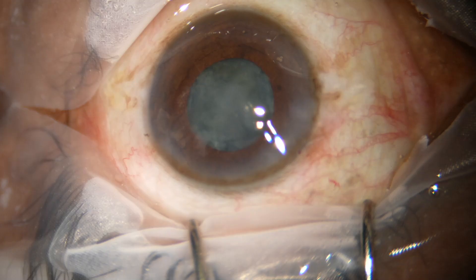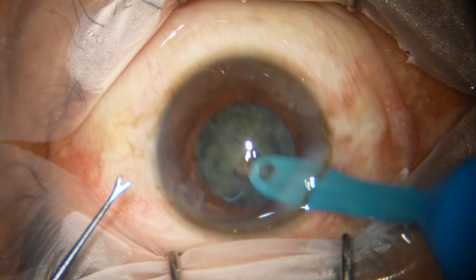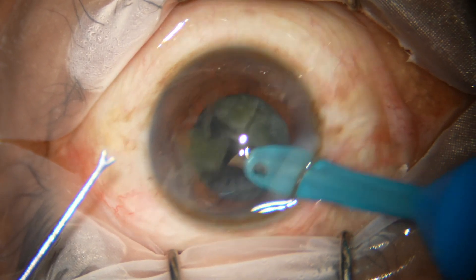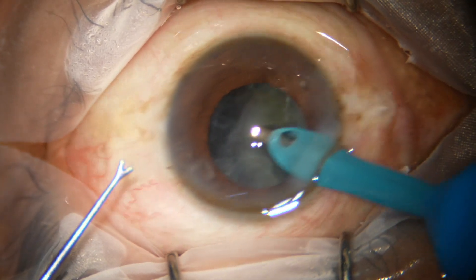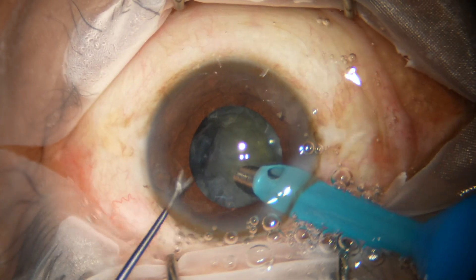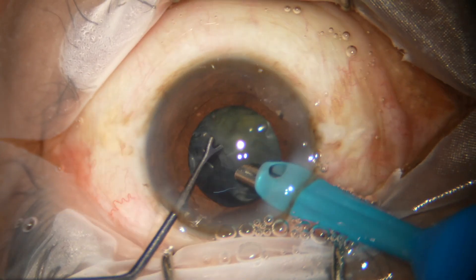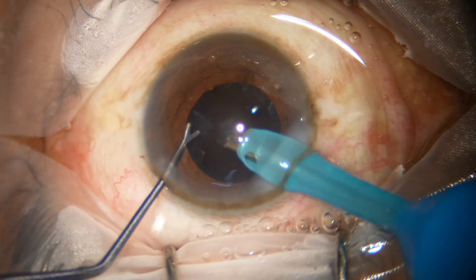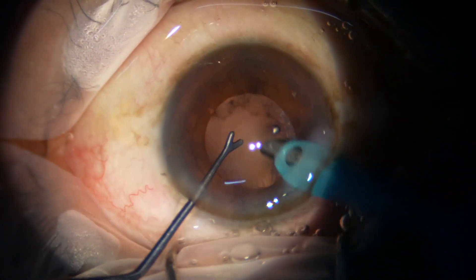Now I come out, go with the handpiece again, and this time this free nuclear piece easily comes to the tip. Note that these two pieces have been emulsified when the Y hook was outside the anterior chamber. Once I want to mobilize the nucleus, I go in with the Y hook and it is done. Now the nucleus is nicely managed.